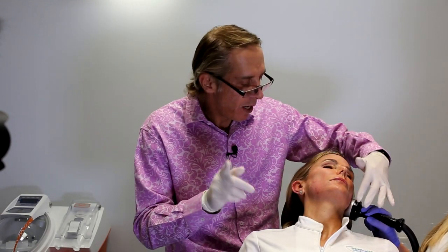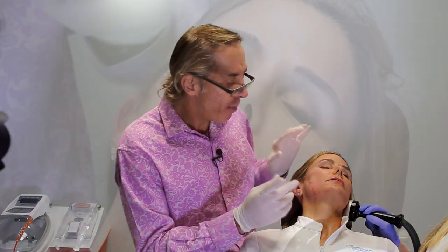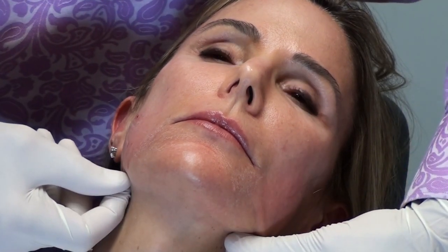So there's also one other suture I didn't talk about. It's called a double barb suture, and it has 2 barbs on it. And that's for using it in the midline to tighten a little tighter, or if you want to use it in the cheek, and it gives kind of a bunching of the cheek to give you a little enhancement of the cheek as well as tightening. So that's called the double barb suture.